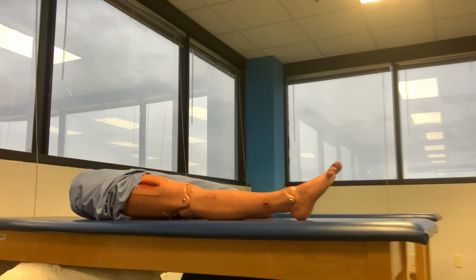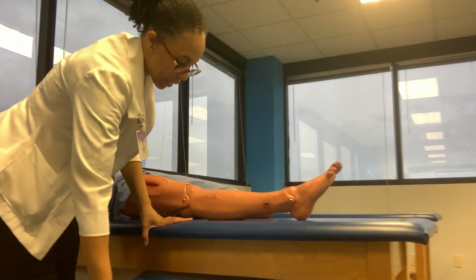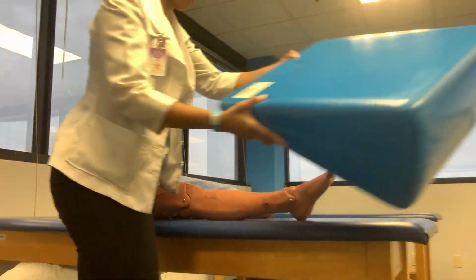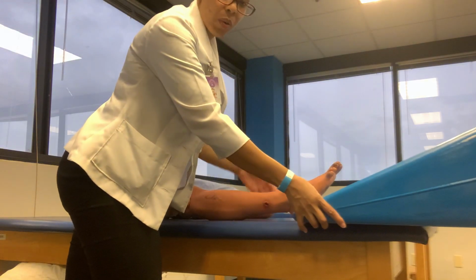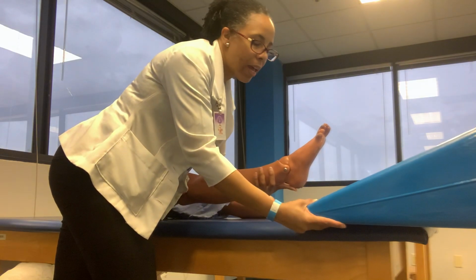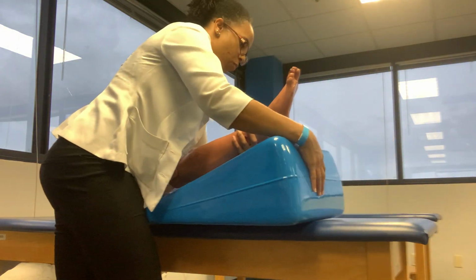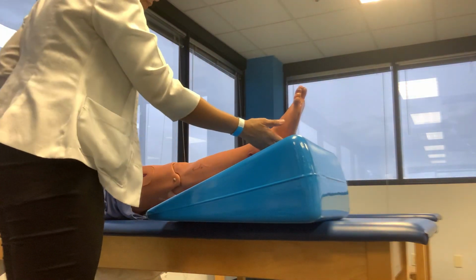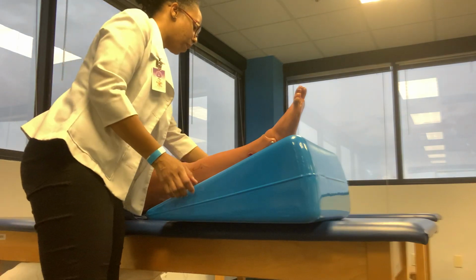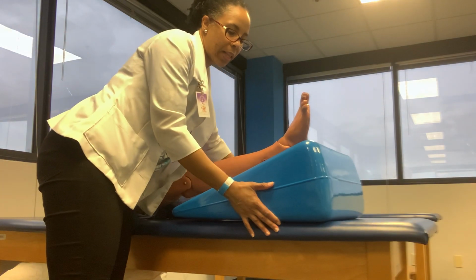But once you get to the table and you get the patient up onto the table, the first thing you're going to do is make sure that you elevate the limb. So you can use the wedge. That's going to help you get the best elevation at first. I'm going to step back here just so you can see a little bit better, but you want to make sure you have nice, good control of the patient's limb because it's a large, heavy, swollen limb. So you get control of the limb and bring the wedge in so that it can at first support that limb. That's the main thing you're going to be interested in fixing first, getting that limb elevated.